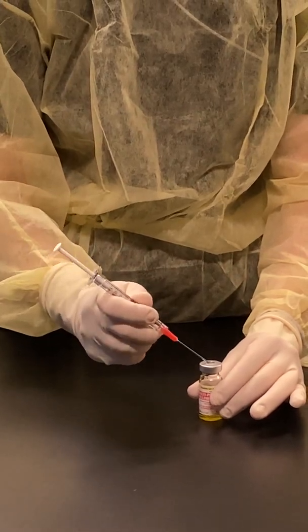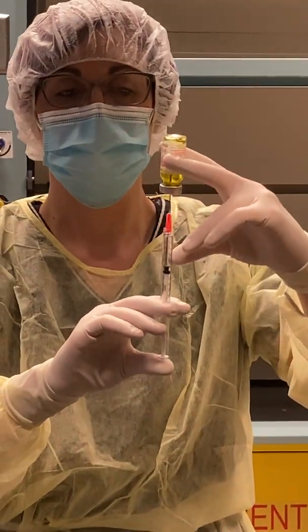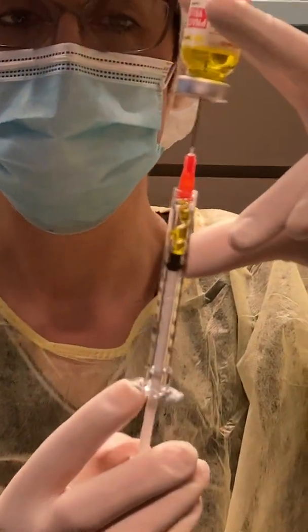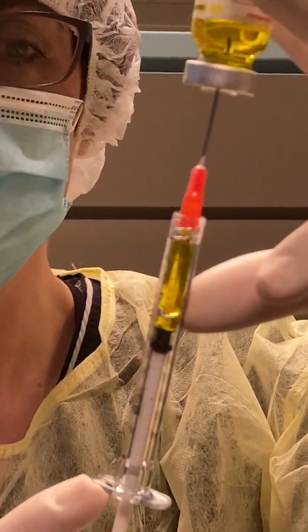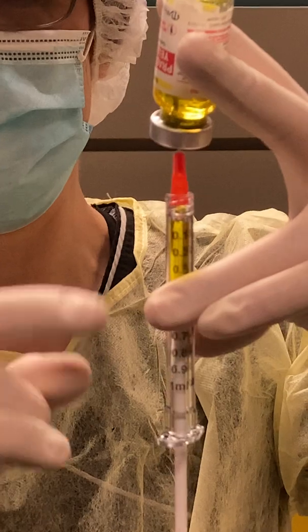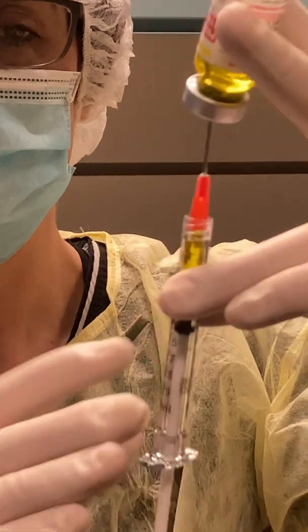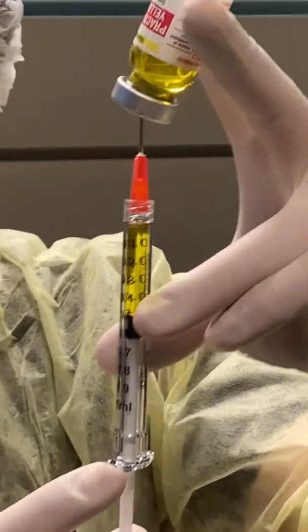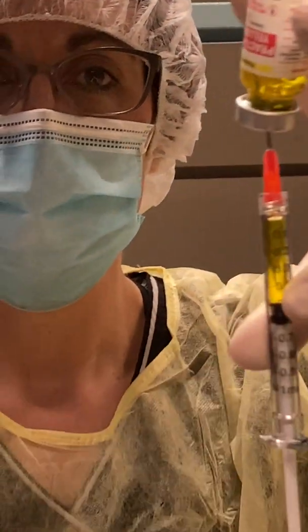Bevel up, push in, and drop. Tap to bring all the bubbles to the top of my syringe, then push the air bubbles out. I'm a little short so I'm going to draw some more fluid. Tap to make sure there are no bubbles, and now I have 0.5 ml.